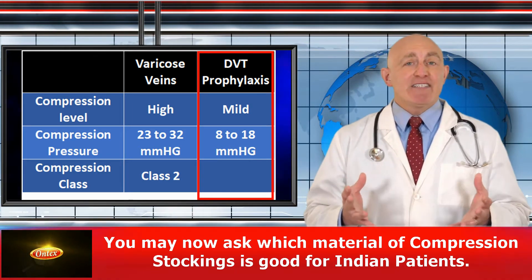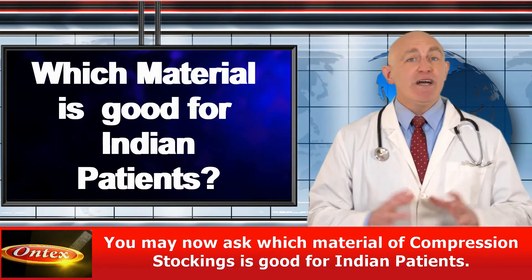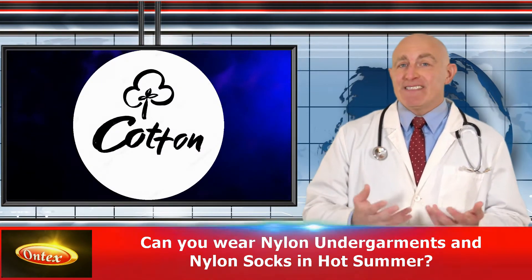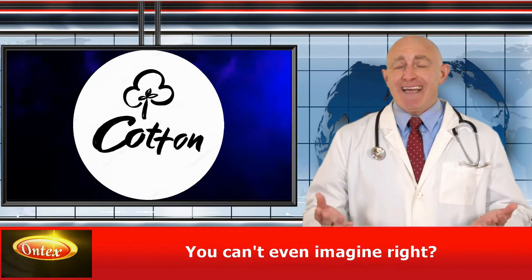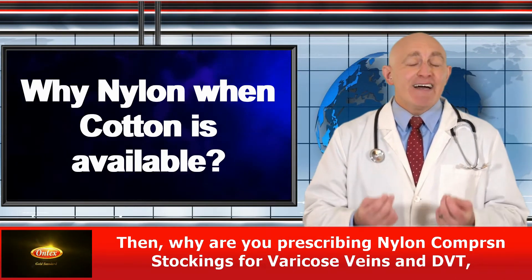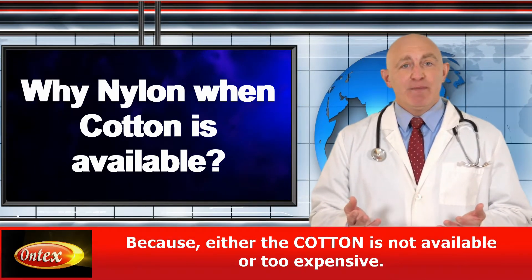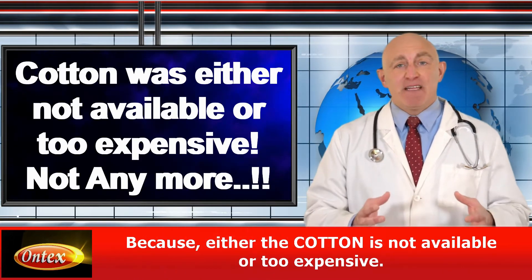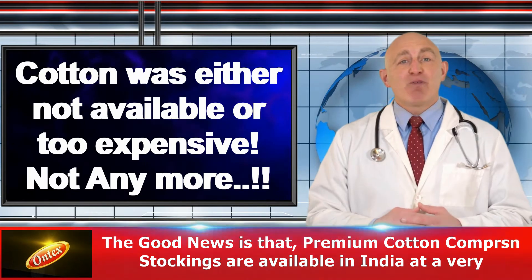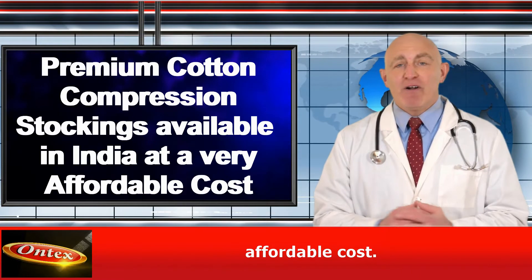You may now ask which material of compression stockings is good for your Indian patients. The answer is cotton. Can you wear nylon undergarments and nylon socks in hot summer? You can't imagine that. Then why are you prescribing nylon compression stockings for varicose veins and DVT for your patients? Because either the cotton is not available or it's too expensive. But not anymore. The good news is that premium cotton compression stockings are available in India at a very affordable cost.